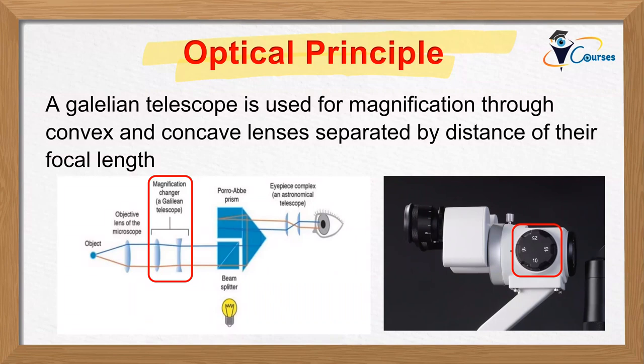the maneuver sometimes being difficult. For example, if you are removing a foreign body from the patient's cornea, you need to stretch your hands, causing fatigue. Also, if you are doing a PRP or panretinal photocoagulation, it will make your hand outstretched, so you need a hand support because of this length of the slit lamp.